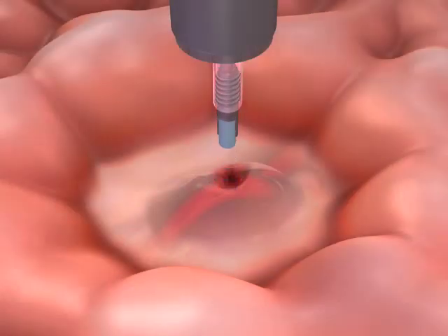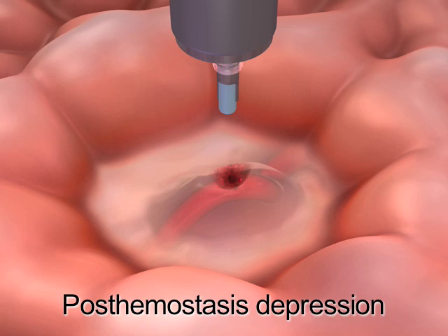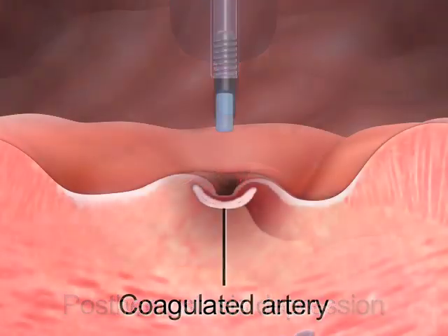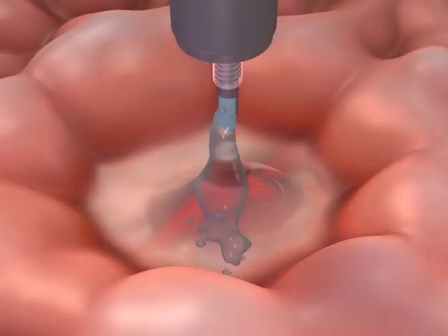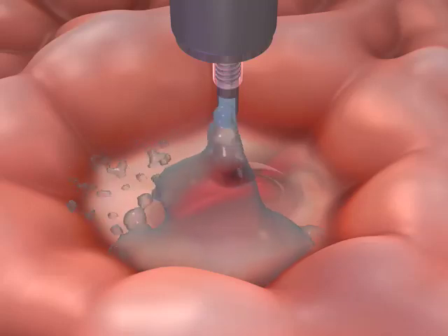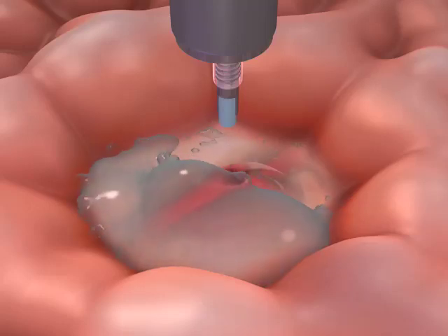Treatment should continue until the active bleeding has stopped, or the protuberance of the non-bleeding visible vessel has been completely flattened. The endoscopist should observe a post-hemostasis depression, or footprint, on completion of the contact thermal therapy, confirming the approximation and fusion of the superficial tissue layers and the deeper tissue layers. This area should then be irrigated with water through the contact thermal probe and observed for any possible post-treatment bleeding.